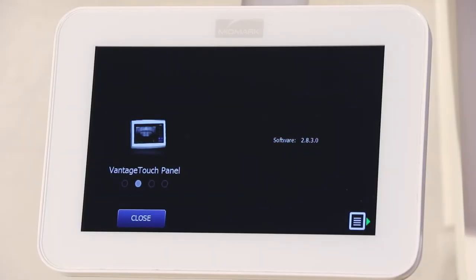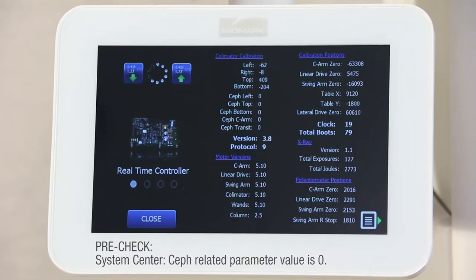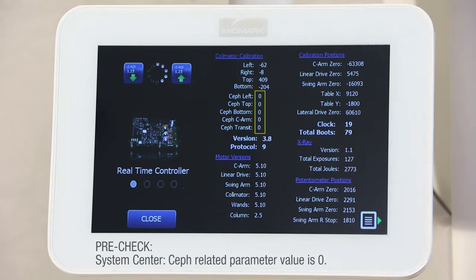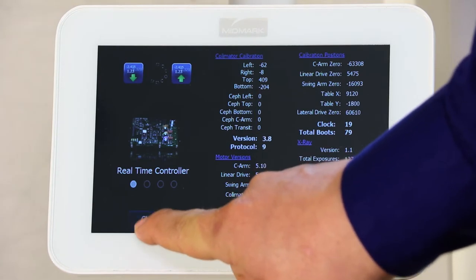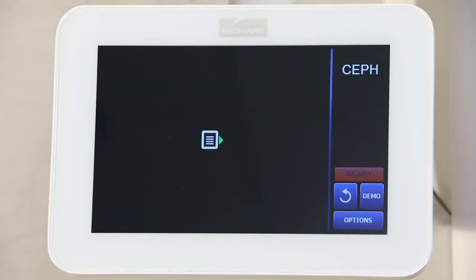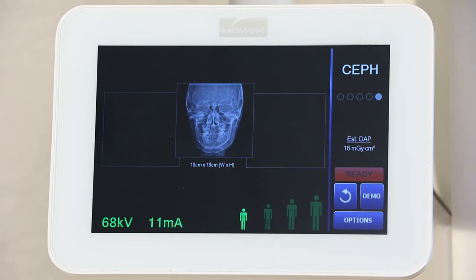If Device Suite version 2.7.1.0 or lower was installed on the machine prior to upgrading to version 2.8.3.0, you will need to verify the Ceph parameters. On the touch screen, look at the Ceph left, Ceph top, Ceph bottom, Ceph C-Arm, and Ceph transit values and make sure they are 0. If these values are not 0, contact Tech Support for further instructions. If these values are correct, press CLOSE, EXIT, and wait until the collimator stops moving. Then continue on to the pre-check for 0-pin positions for X, Y, and R axes.